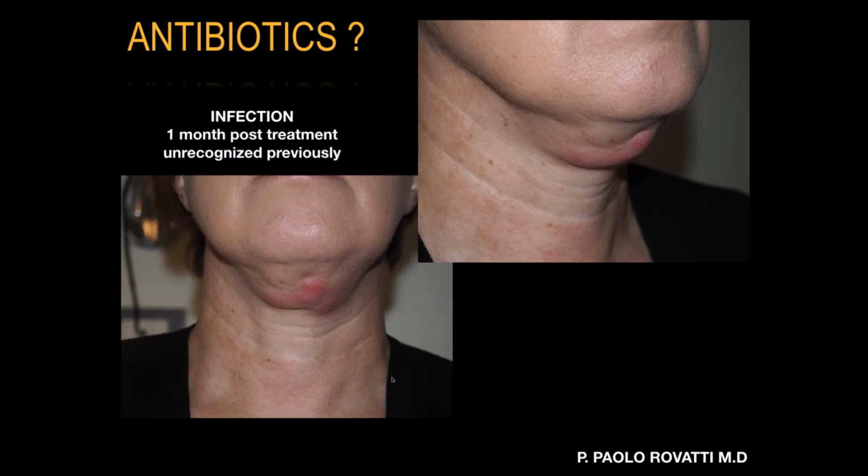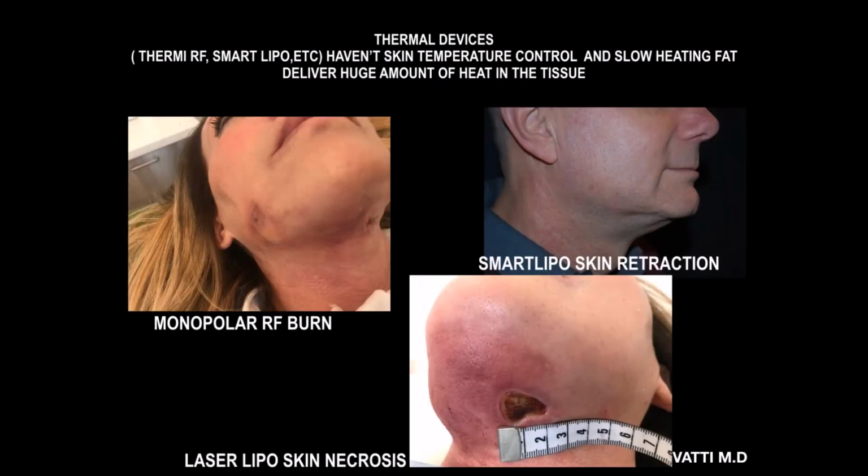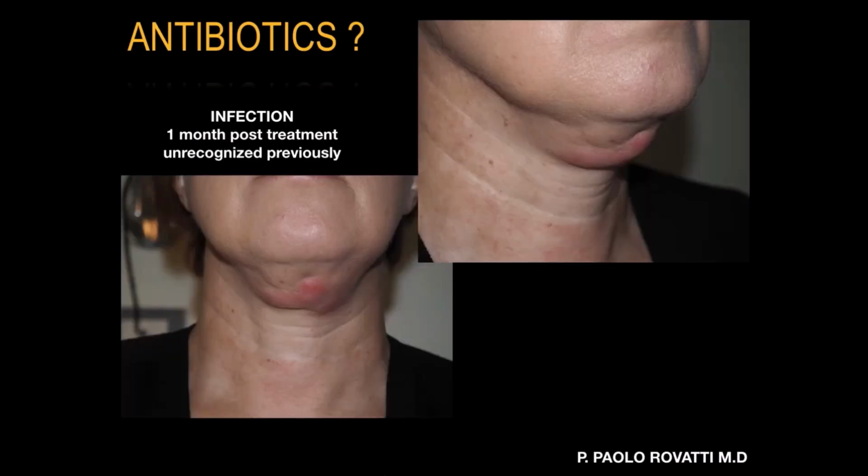But sometimes this is a phase of the treatment. A doctor sent me this patient and asked, what happened? Maybe too much heating. No, I think it's very soft, it's smooth. Well, you can press and find something. It's edema, but maybe infection. Did you give her antibiotics? No, obviously, I don't give them for this. Okay, but I opened it and she was full of infection. So we drained it, but this is just to advise you: sometimes antibiotics could be good.